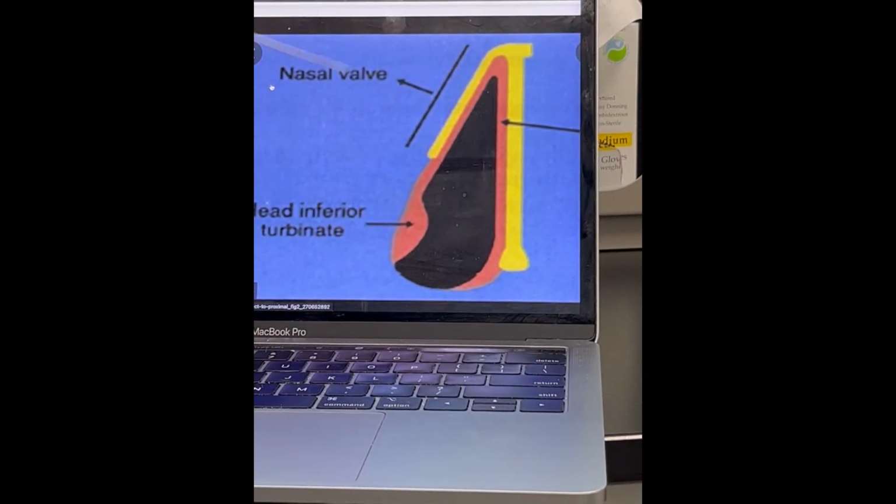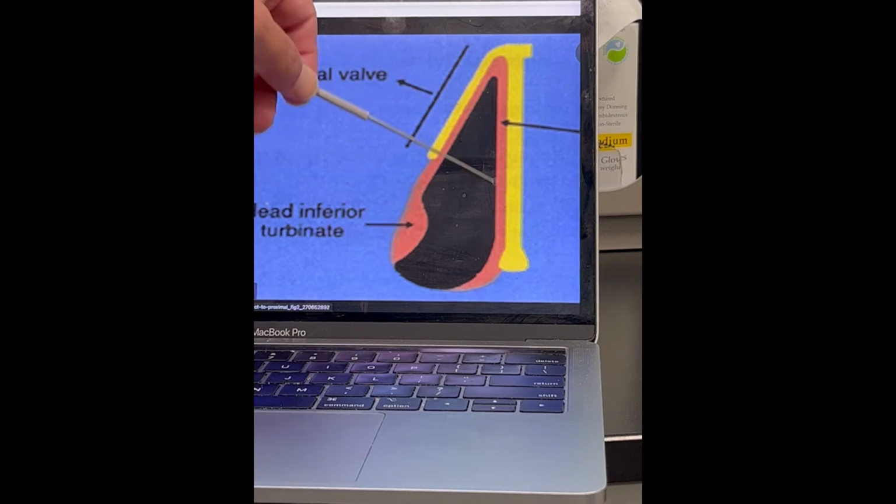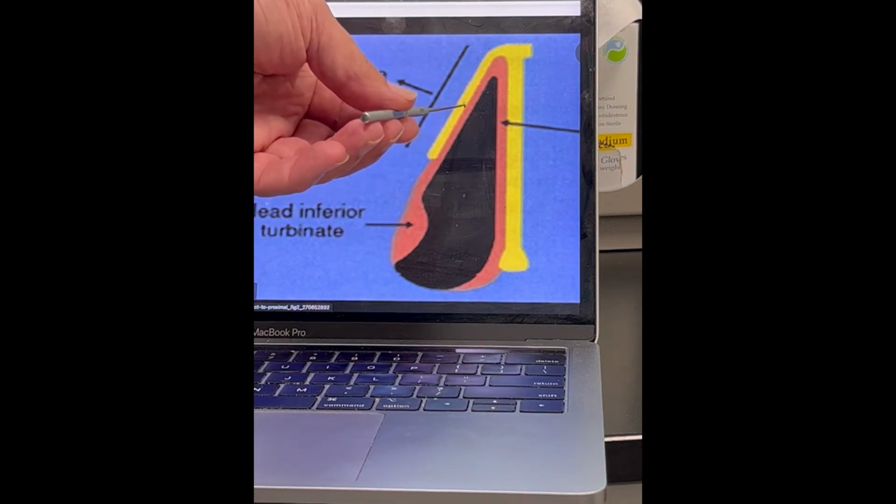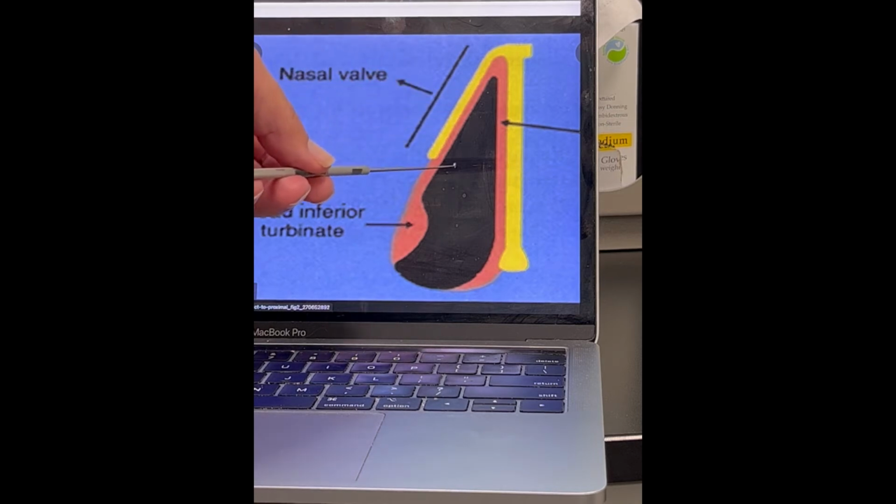In some of our other videos, we discussed the nasal septum and the inferior turbinate. There's actually a swell body in here as well. A swell body is like a turbinate that's on the septum. All of those can compromise this angle and compromise the nasal valve. What we're going to be talking about today is a procedure where we can reshape this cartilage. Using radiofrequency, we can lift this cartilage and stiffen it so that it no longer collapses as easily when air goes through that angle.